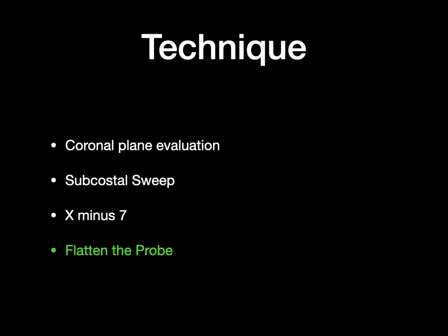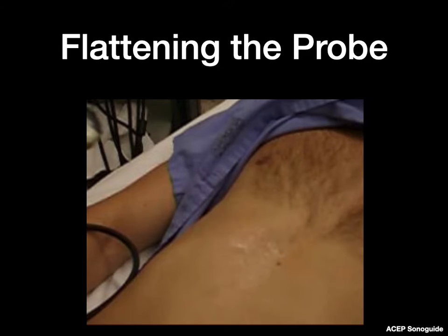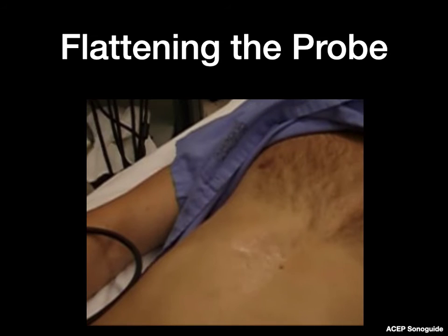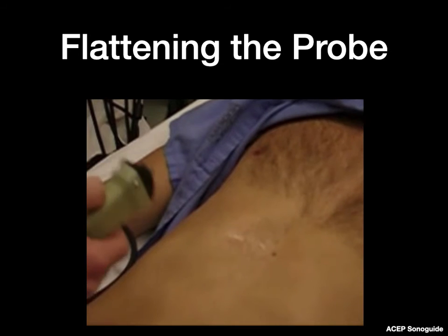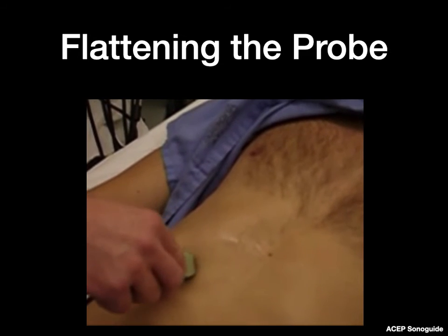Finally, let's cover flatten the probe. The final technique essentially attempts to locate the gallbladder in a coronal plane by flattening the probe as much as possible into the abdominal wall subcostally. Once identified, the probe is rotated as needed to elongate and shorten the gallbladder into longitudinal and transverse planes.